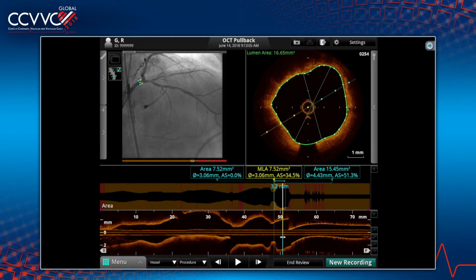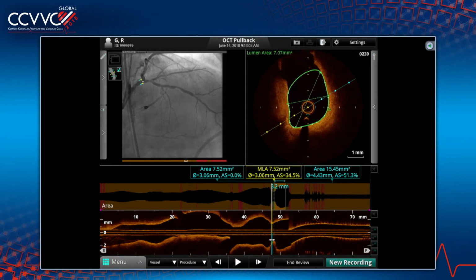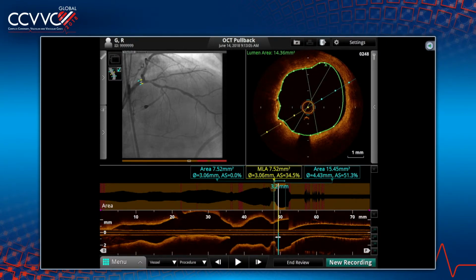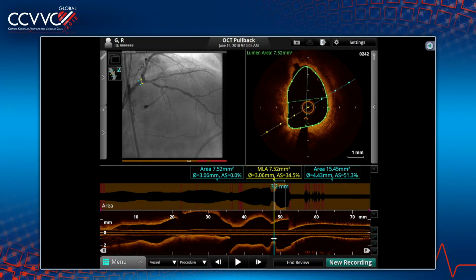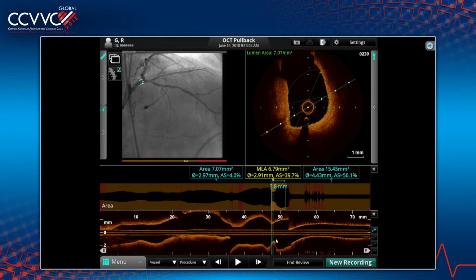How much are we getting? 7.5? That's what it turns out. That's the way they become. Well, I can tell you angiographically today, compared to the last time when we had the film, it looked much better. Whatever the region was, clearly it was 60-70% angiographic, and this is the type of case.